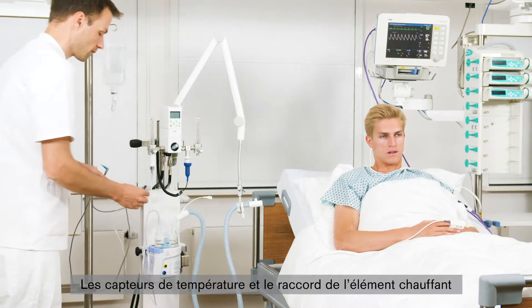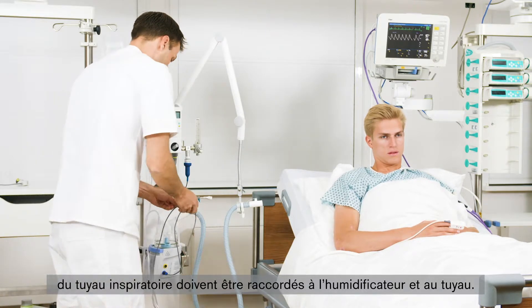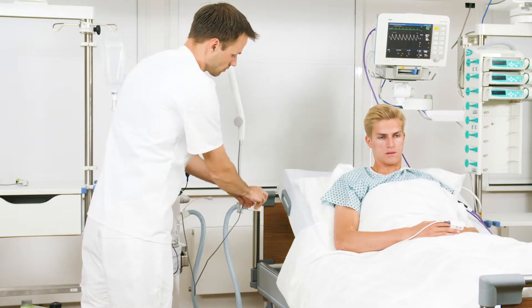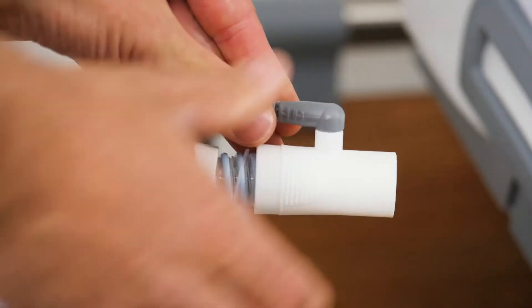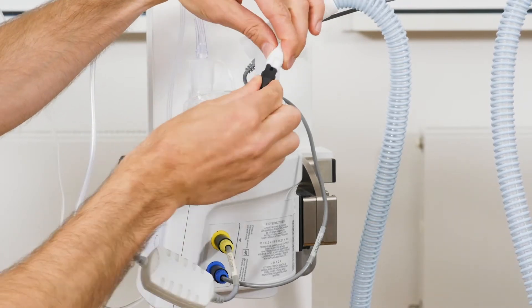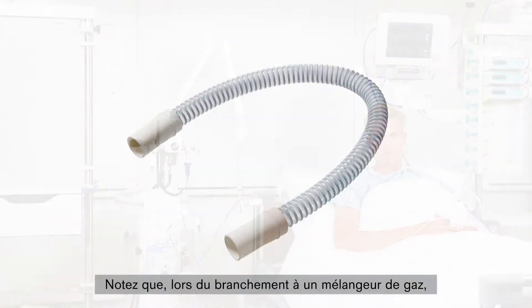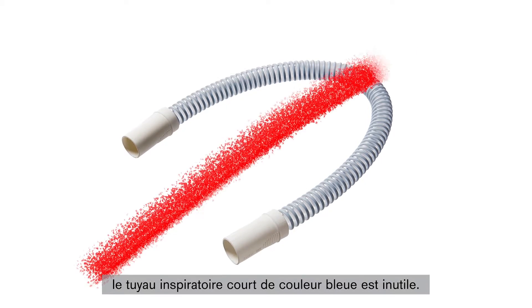In addition, the temperature sensors and the connector for the inspiratory hose heater must be connected to the humidifier and the hose system. The breathing circuit system is now fully connected. Please note that when connecting to a gas blender, the short blue inspiratory hose is not needed.